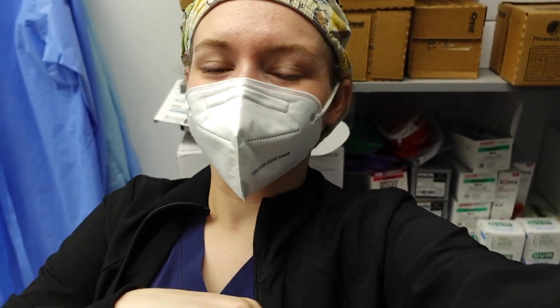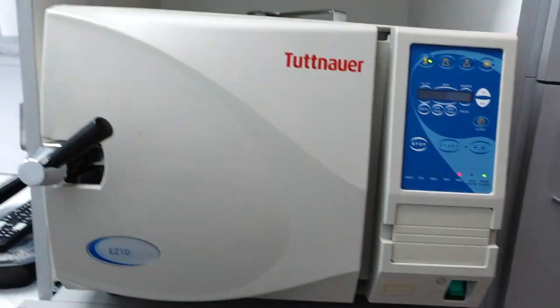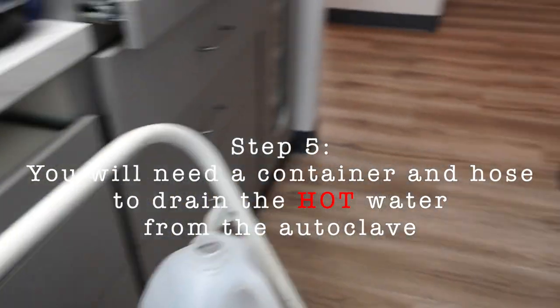I'll see you in 30 minutes whenever the cycle's done. So it actually failed, but luckily we're not doing tools right now, so it doesn't really matter. I'm going to go ahead and open it. I have my water jug and then I have my little cord.